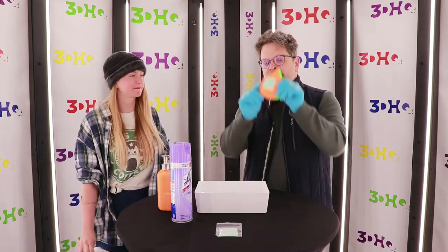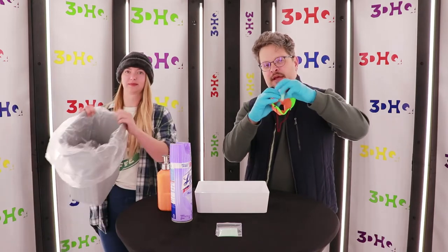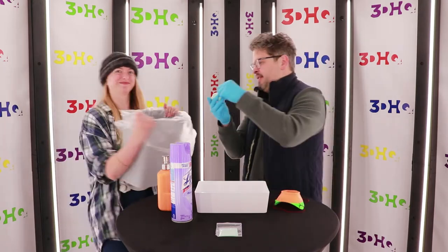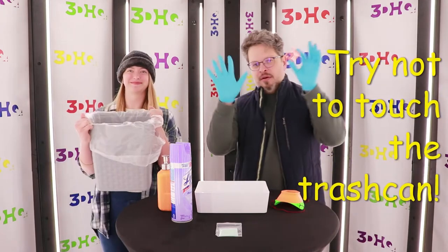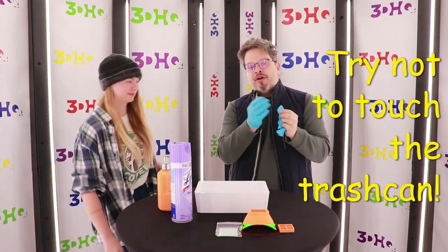The first thing you want to do is make sure that you're popping out the filter and tossing it in the trash. Once that's done, you're going to want to throw your gloves away too.